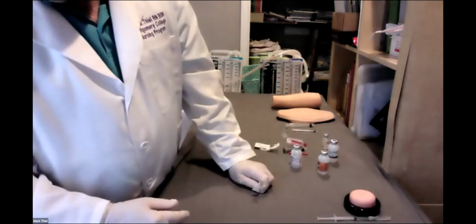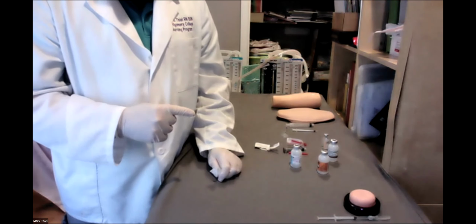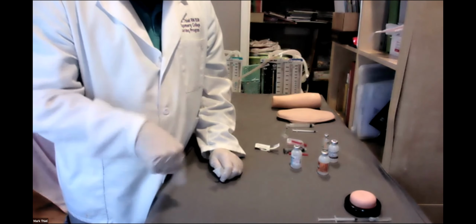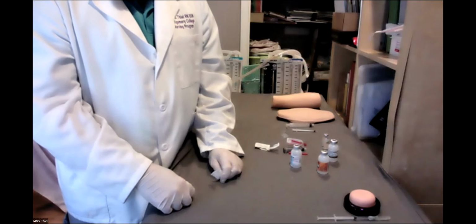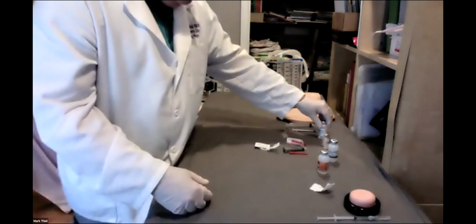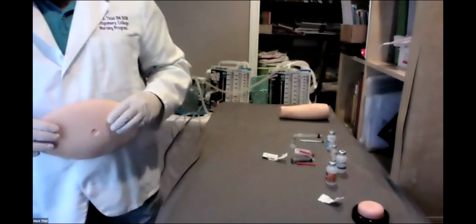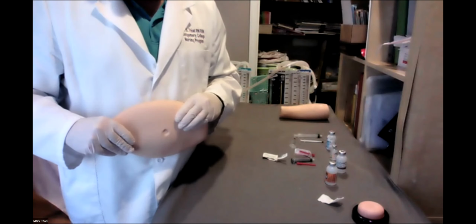I spend extra time on the intramuscular because now, as we do the sub-Q and the intradermal, the drawing process of the medication is the same. So, subcutaneous. Site choice. We need what to work with? Subcutaneous tissue. All right.